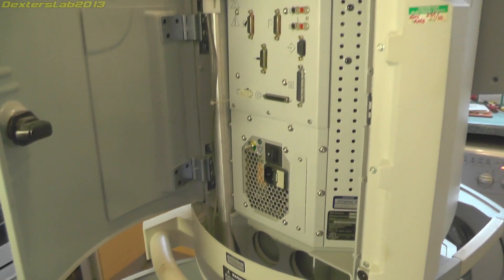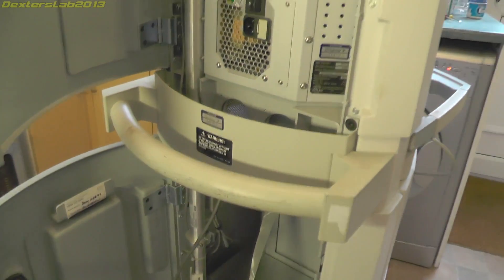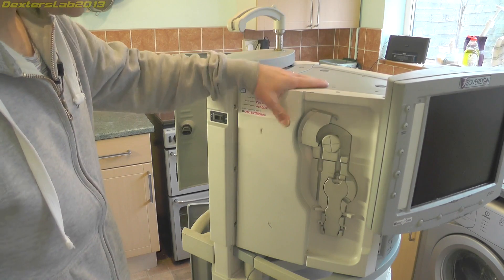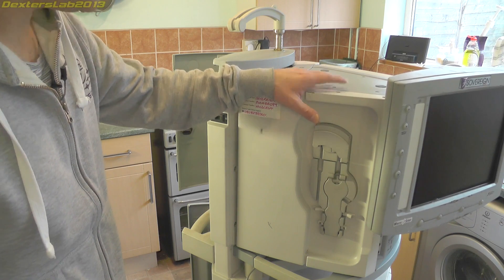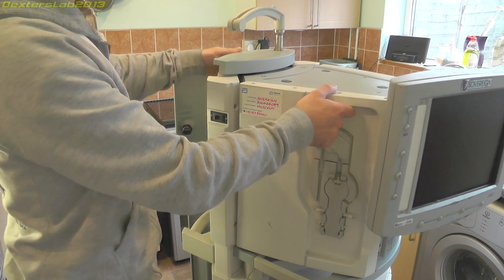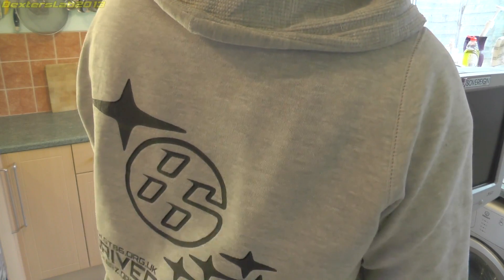What I'm going to do is remove all the major components out of this, so we've just got the wheeled chassis bit which I can dump outside, and then we'll have a look at the other bits in detail. Now this top section which has all the gubbins in it actually detaches from the main unit. There's a locking thing around the back — you just pull that and turn it and it releases this from the base.